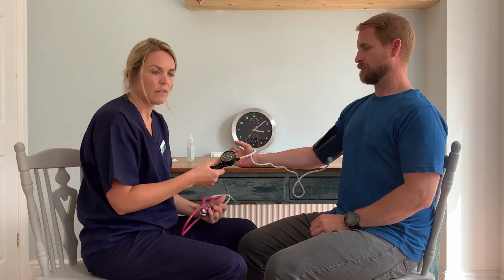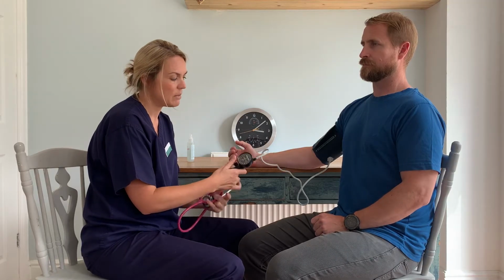And I'm now going to take the blood pressure. So I've got that estimated systolic reading. What that means is now I can pump up the cuff again to 20 millimetres of mercury above that estimated systolic reading. So I can pump it up to 150 millimetres of mercury, and then I should be able to take the blood pressure accurately.